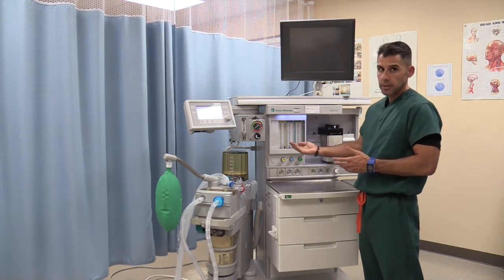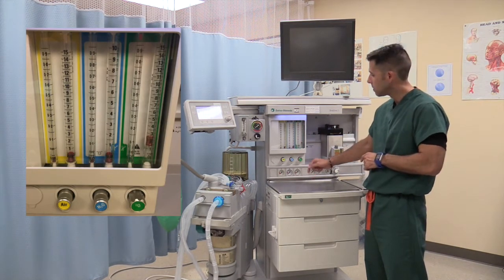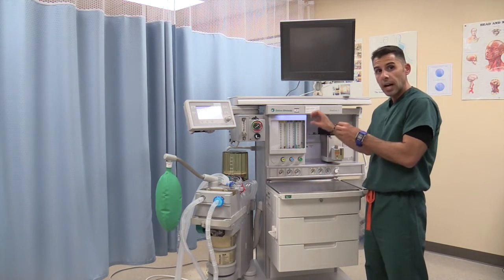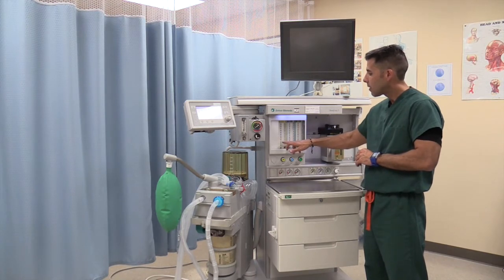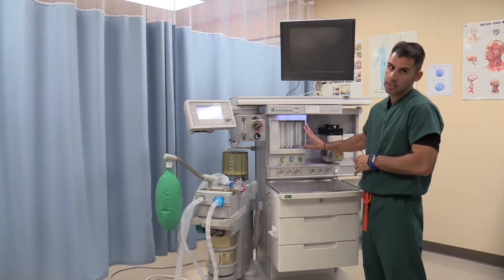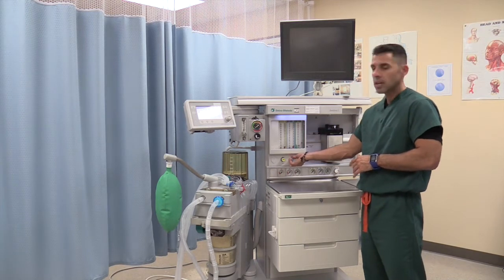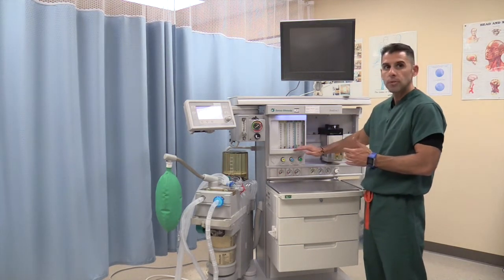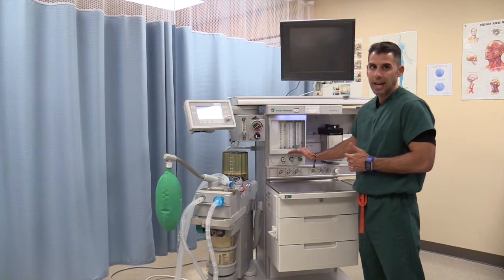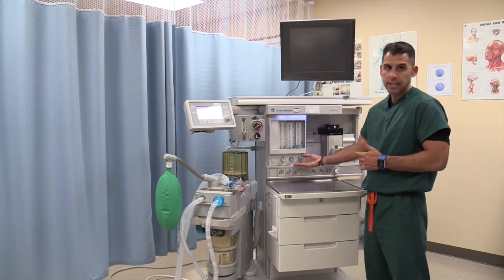In keeping with the color-coding, you will notice the flow meters here, also color-coded to match the back of the anesthesia machine — oxygen, nitrous oxide, and air. The positioning of oxygen is always closest to the common gas outlet, meaning oxygen is the last gas to leave. If we have a crack in one of the flow meters, it will not allow you to deliver a hypoxic mixture. Another safety mechanism is the nitrous oxide and O2 proportioning: if you decrease the oxygen all the way down, the machine will shut the nitrous oxide off. This is a proportioning device, or interlink safety device.